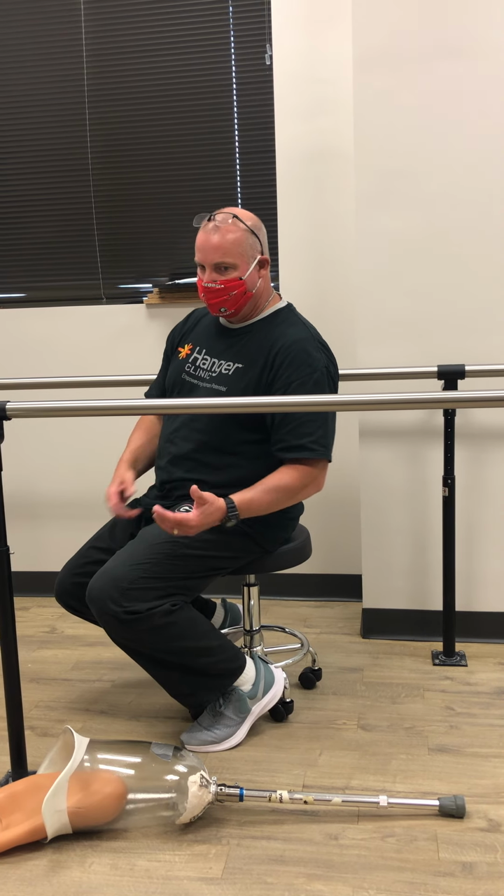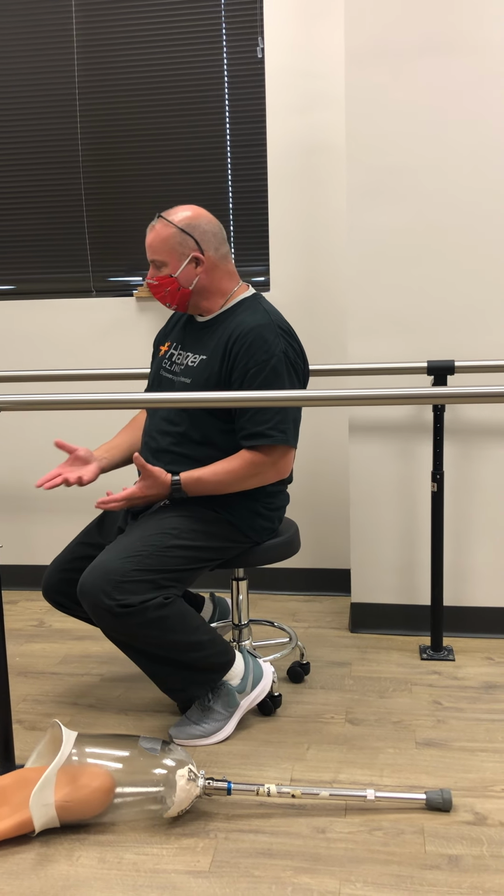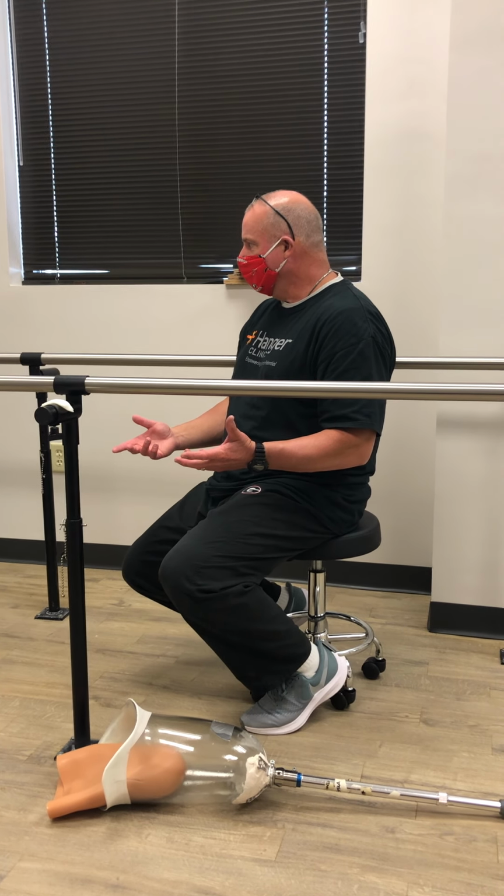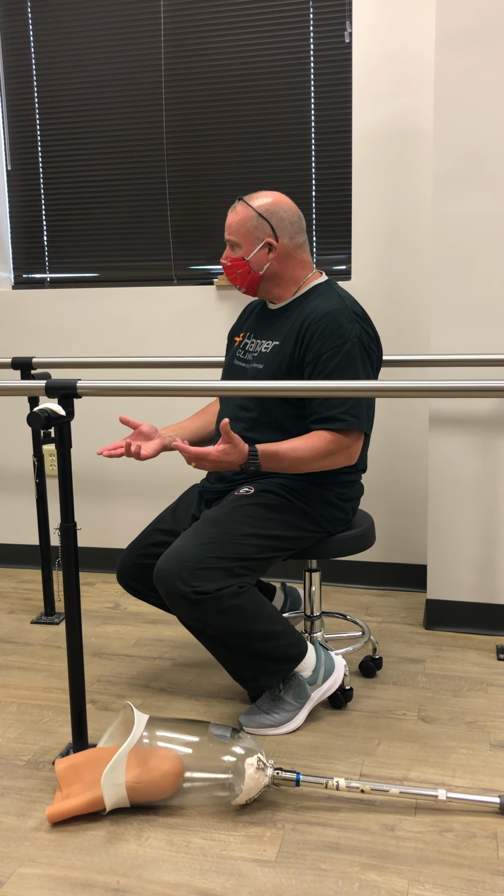So if somebody's fit is deteriorating and they can't control the knee, the first thing they'll say is, how's the socket fit? And then a lot of times they want to see the alignment.